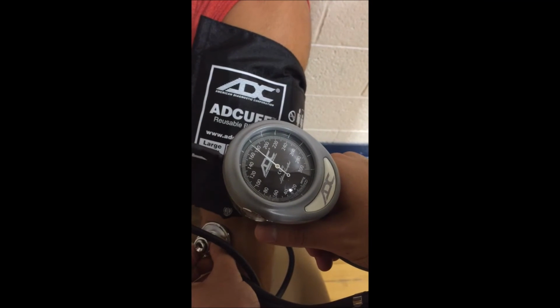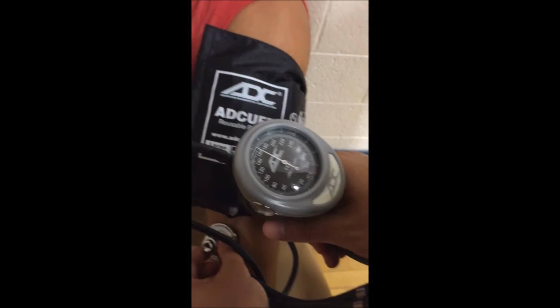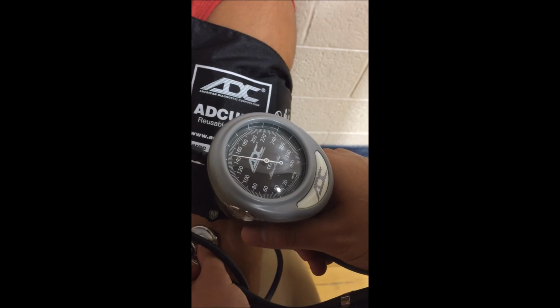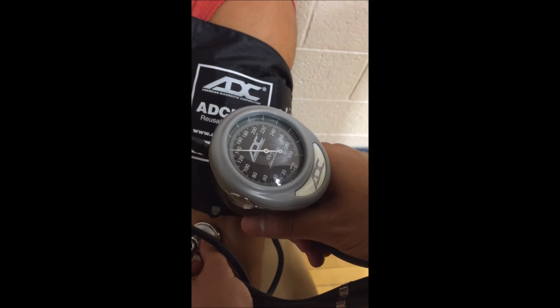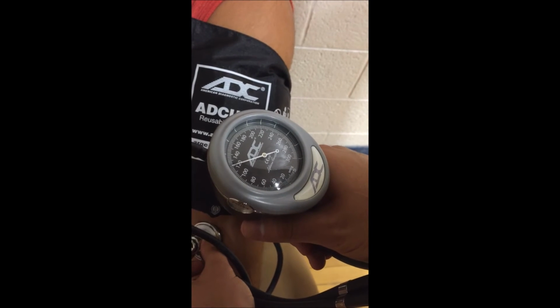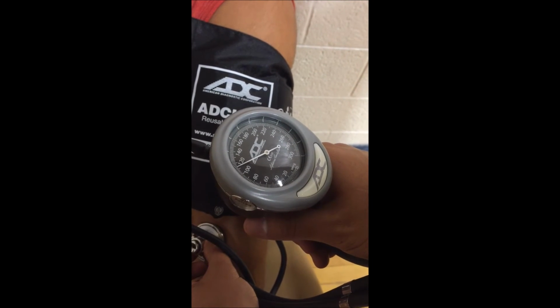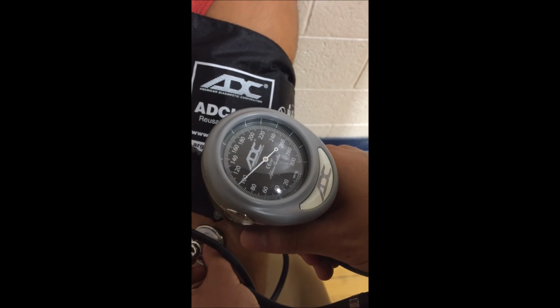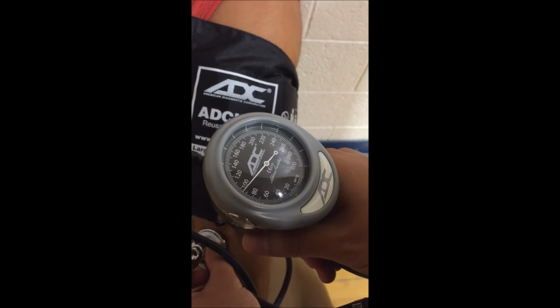Slowly release pressure at a rate of 2 to 5 millimeters of mercury per second. While releasing the pressure, you will be listening to a sound similar to that of a heartbeat, known as the Korotkoff sounds. The first Korotkoff sound will indicate systolic blood pressure. The final Korotkoff sound will indicate diastolic blood pressure.